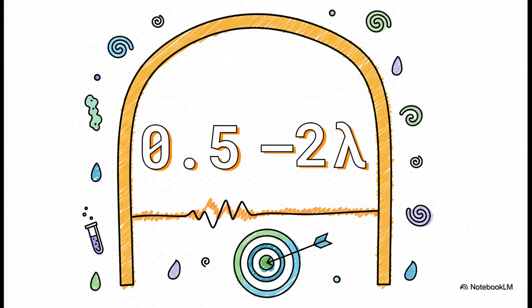And that calculation brings us to this right here, what I like to call the golden window. The Greek letter you see, lambda, just represents the labeled sensitivity of our test. Basically, the smallest amount of endotoxin it's designed to detect. For a test to be valid, our result has to fall between half of that value and double that value. This range is there to account for normal, expected variation in any experiment. Anything outside of it, though, suggests something's off.